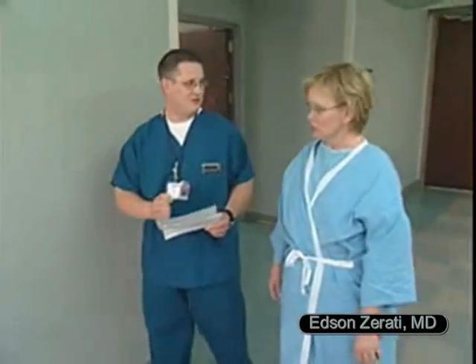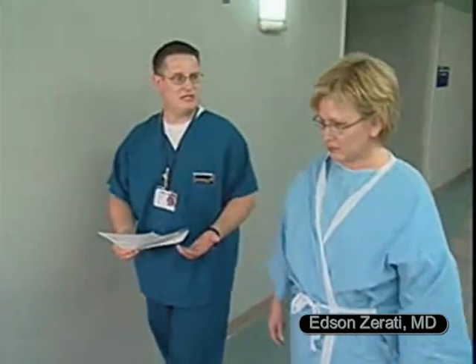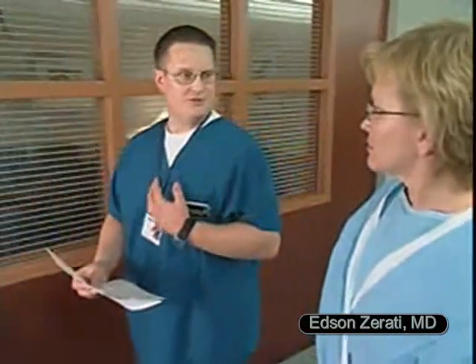Tell your MRI technologist if you have metal or electronic devices in your body because their presence may be a safety hazard. The magnet may disable your electronic device or affect the MR image quality. Before your exam, the MRI technologist may confirm your health issues and answer any last-minute questions.